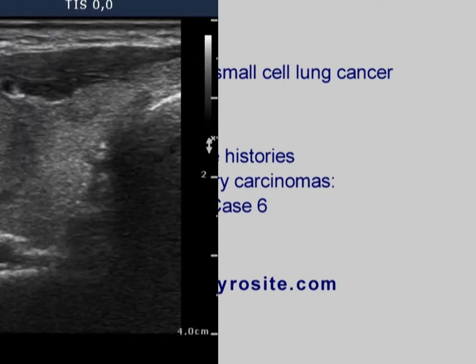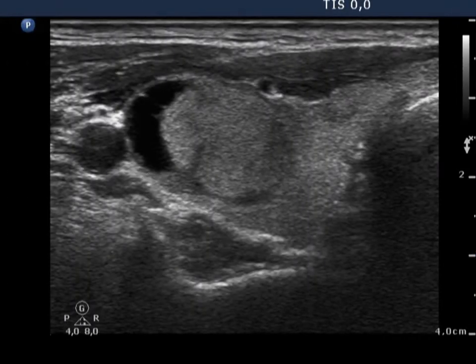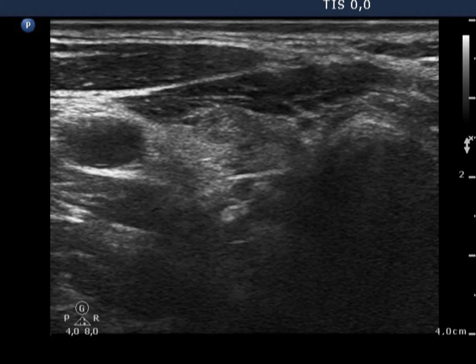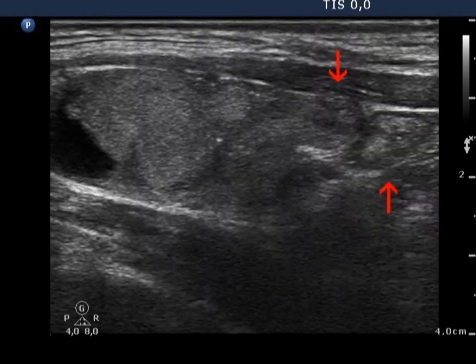There is an echonormal cystic nodule in the upper lateral part, and a hypoechoic inhomogeneous lesion in the middle part of the right thyroid.